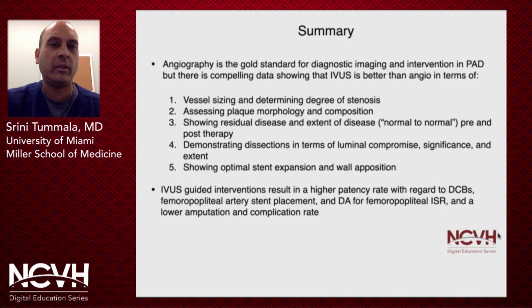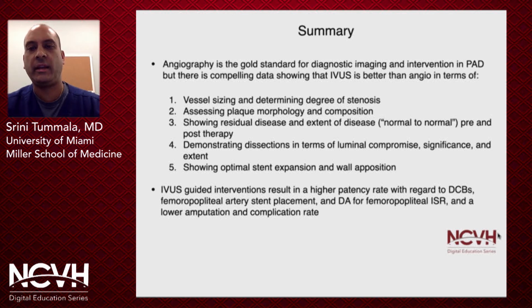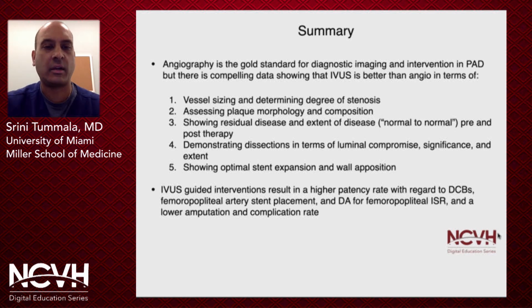So in summary, we know that angiography is the gold standard for diagnostic imaging and intervention in PAD, but there's compelling data showing that IVUS is better than angio in terms of vessel sizing, determining the degree of stenosis, assessing plaque morphology and composition, showing residual disease and extent of disease, in other words, treating normal to normal, pre and post therapy, demonstrating dissections in terms of luminal compromise, significance, and extent. And IVUS has been shown to be better at showing optimal stent expansion and wall apposition compared to angiography.